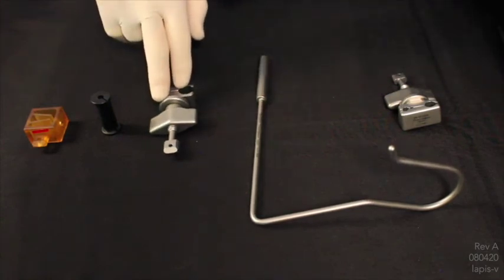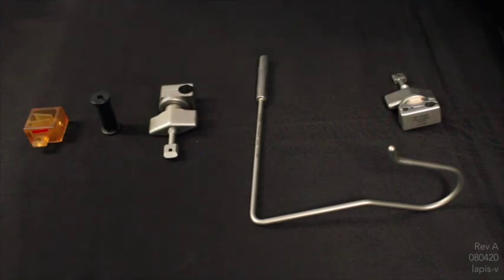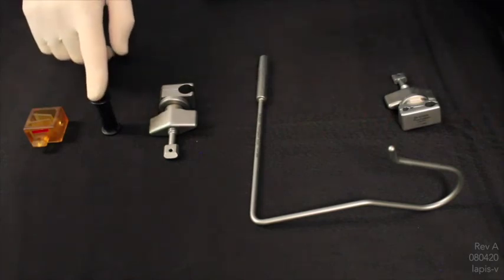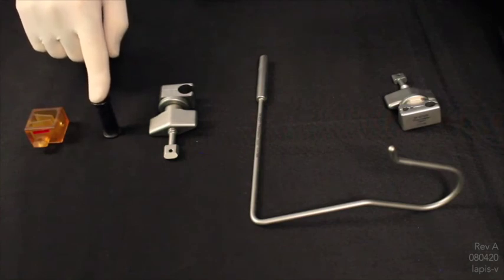The scope grip and bushing holds the scope and instruments tightly, prevents rotation of angled scopes. Bushings may be custom ordered to any size. The scope grip bushings come in 5 and 10 millimeter.